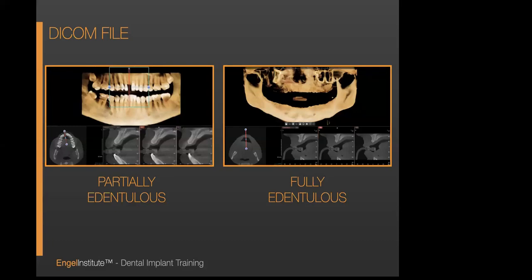I charge $175, and we have very, very few rebukes, if any, on not being able to take a CBCT scan. I want them in the machine because, as you see here, if they're in the machine, I can speak to them and I can show them. And many people learn this way. Our objective is not to have our CBCT scan fee so high priced that we push them out the door. I feel that $175, if they can't afford the CT, then they can't afford an implant.